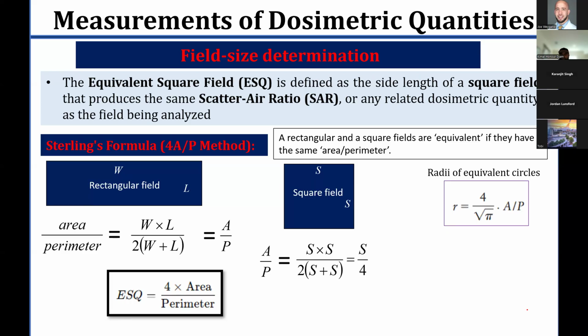As the field size increases, more of the radiation is scattered by the collimator and within the patient or the phantom, which in turn adds to the primary beam contributing to dose within the patient. Now, keep in mind that in practice, it is impossible to measure every field. In other words, not every field is a perfect square. When we really think about it, tumor geometry, patient anatomy, and shielding requirements often produce irregular fields. To handle this situation, the concept of equivalent square fields is used.